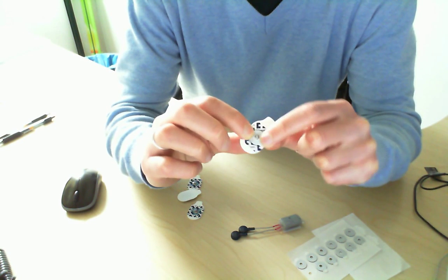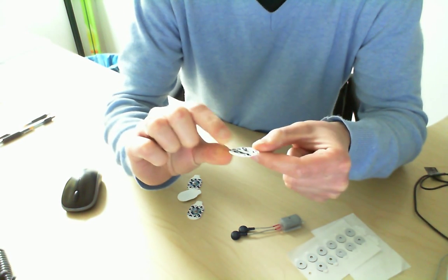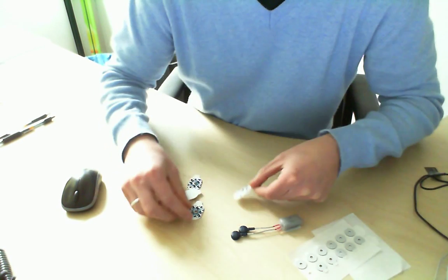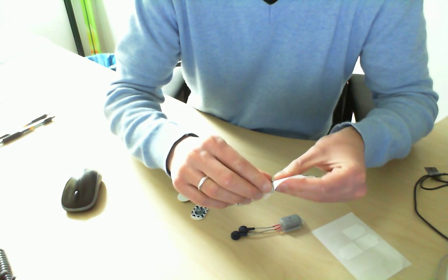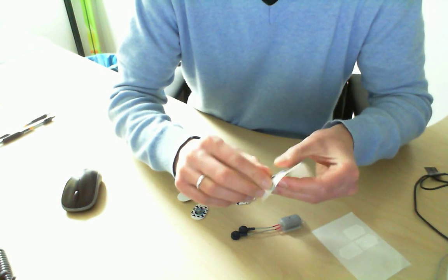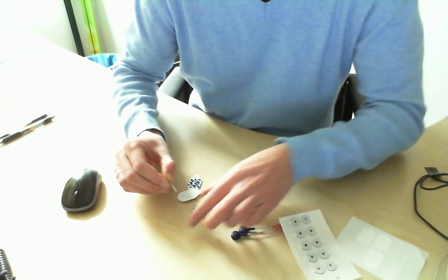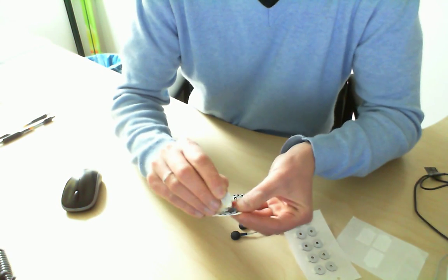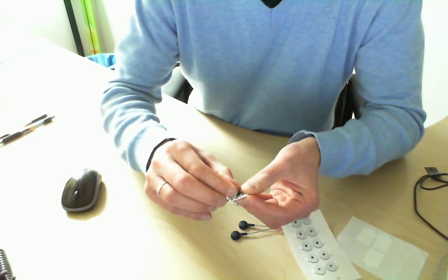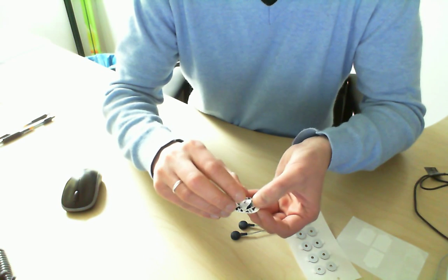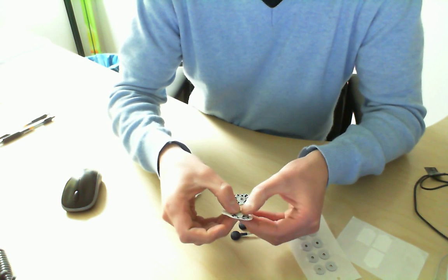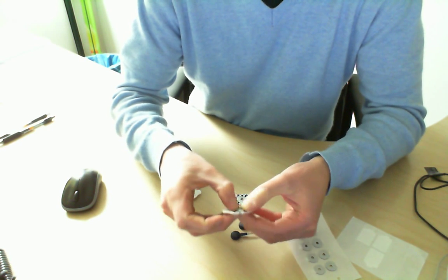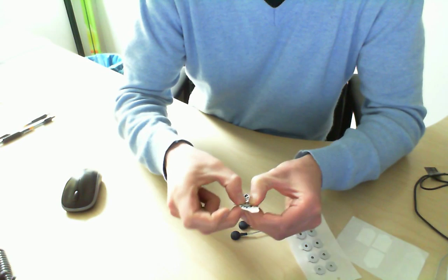You can actually do this the day before, so you don't have to do it when the subject is waiting. As you see, you can do it for both. Just put it there and press to make sure it sticks.